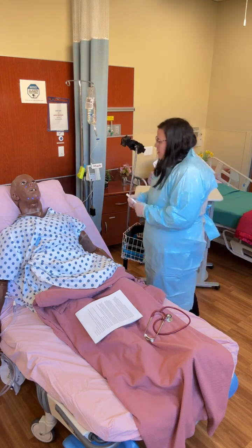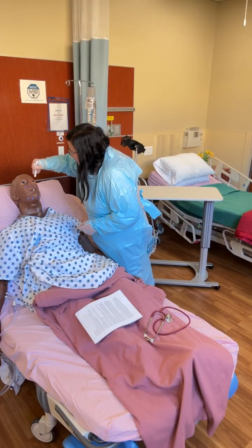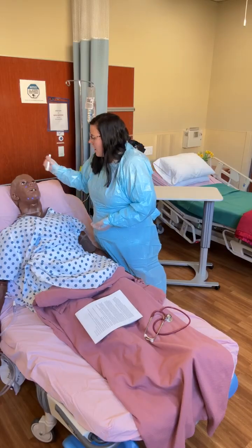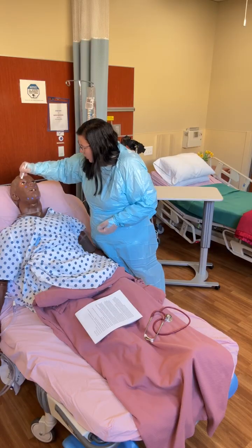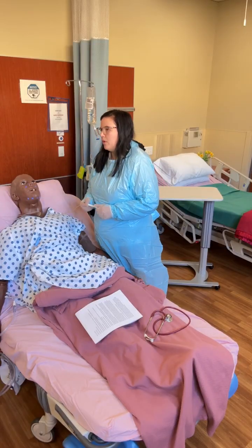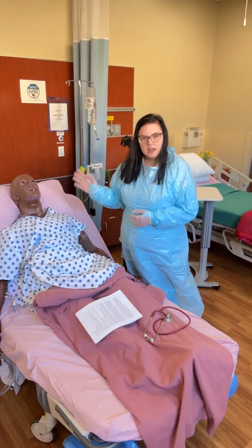And then, Stan, I'm just going to check your pupils here, okay? Okay. So I look. And if the lighting is correct, if it's dark enough in here, he does have reactive pupils. So if they're supposed to react, they will. The sun is kind of coming in through the window right now, so I'm not seeing it quite right. But if you take your time and try, you might see it. If you don't see anything, you can just say, sim question, what are my pupils? They are equal and reactive bilaterally. Perfect. Okay. So that's how you're going to kind of go through a vital sign assessment on your patient.